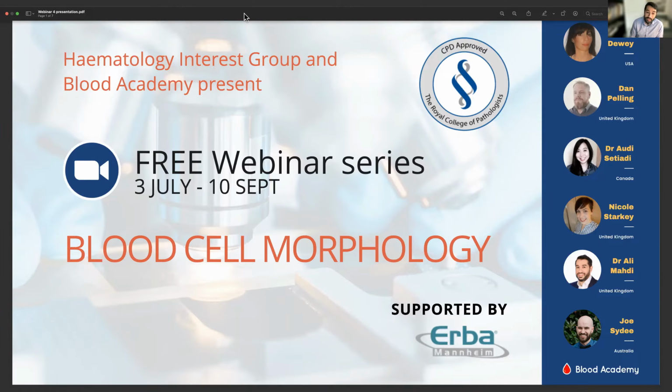Our focus today is going to be on granulocyte cases with plenty of neutrophils and interesting cases to go through. We've got three cases to go through, and we really want to make this as interactive as possible, get you to engage in the cases, and stimulate discussion and debate as well.